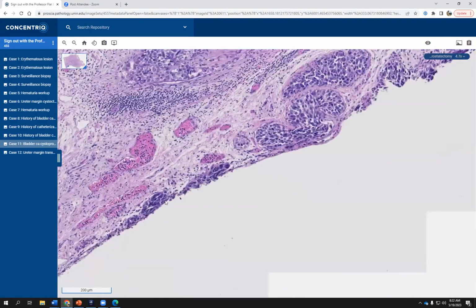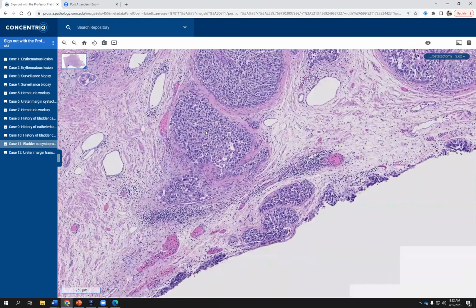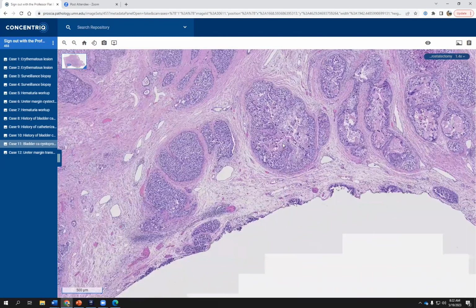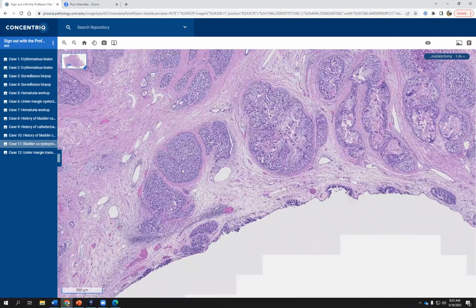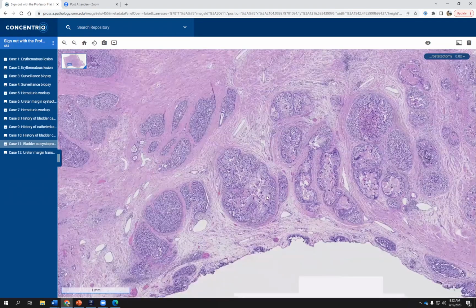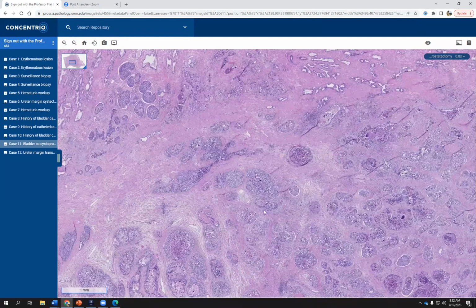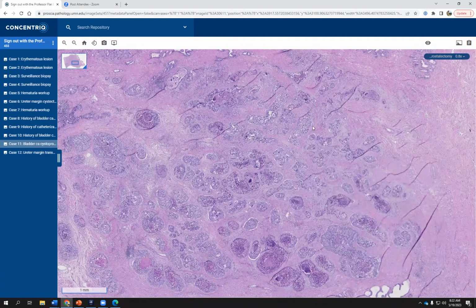As we follow this carcinoma in situ, it's on the surface in most of these areas, but you can see it's entering into the underlying prostatic ducts and the prostatic acini as well. So again, as I said, this is a fairly common phenomenon, and the urothelial cancer can crawl through the urethra, enter into the prostatic ducts and into the prostatic acini and expand them, and can go quite deep because all these acini and ducts are actually connected, right? So they can follow that path and grow quite extensively into the prostate itself.